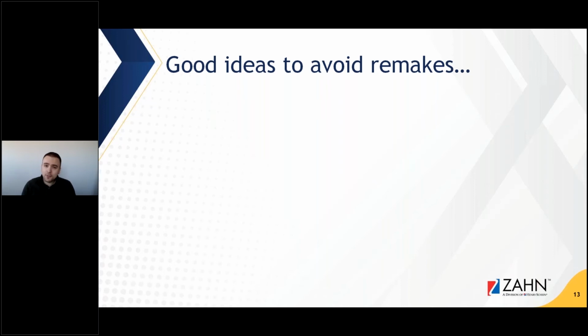Now let's shift a little bit. Let's talk about good ideas to avoid remakes. As somebody who works in the digital field for quite a while, we see a lot of strange scans, if we can call them that, come in. And over time, we've learned kind of what works and what doesn't and what to look out for.